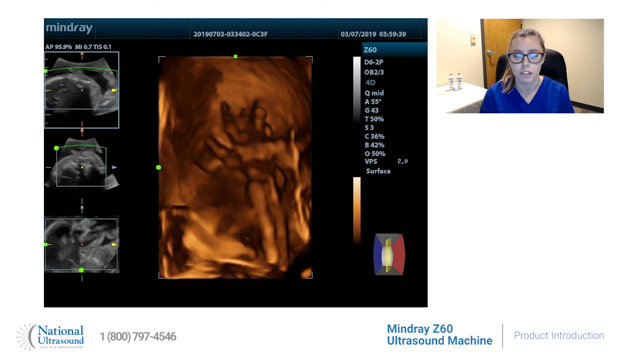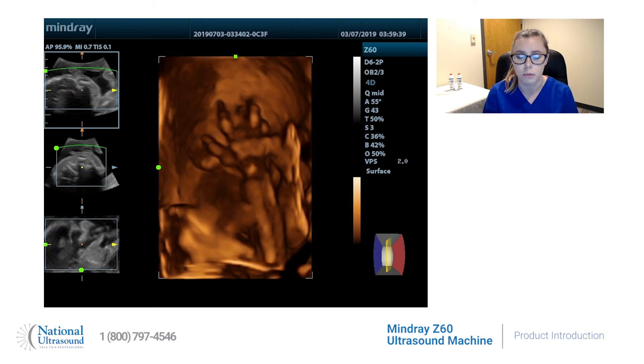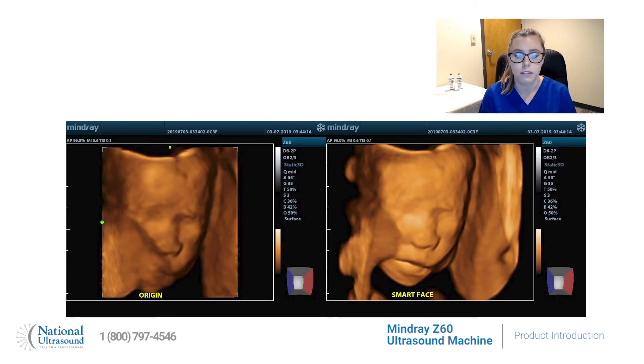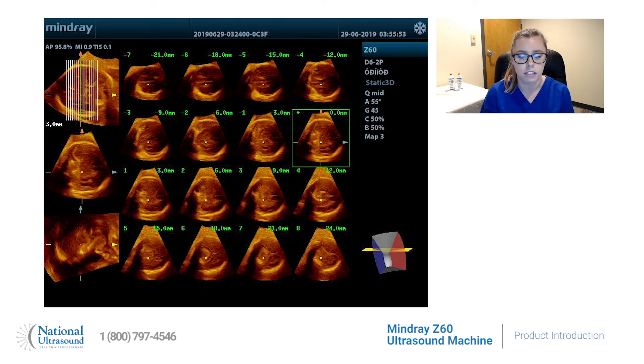Smart OB for the auto-measurement of the most frequently used OB scans, the EyeLive feature that gives you a realistic view of the fetus, the Smart Face feature that allows for the fast removal of face occlusions, and the EyePage feature that displays volume depth with multiple parallel 2D images.